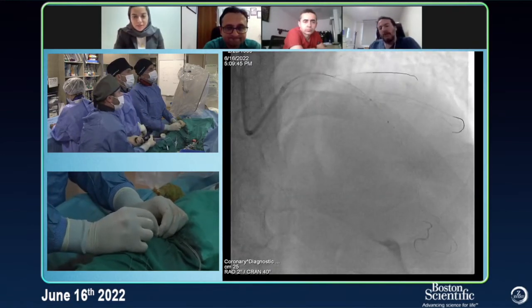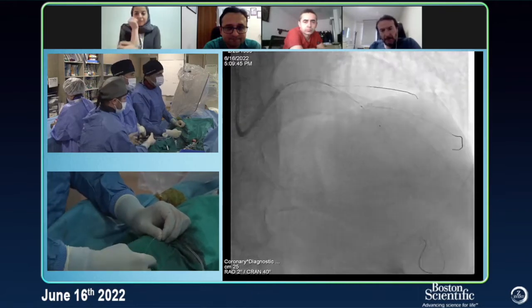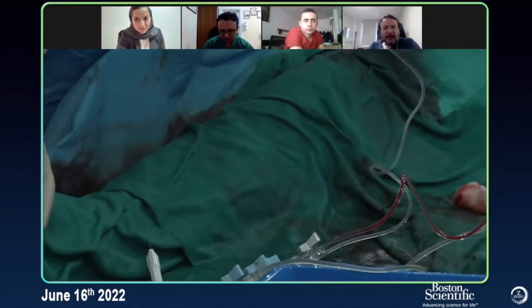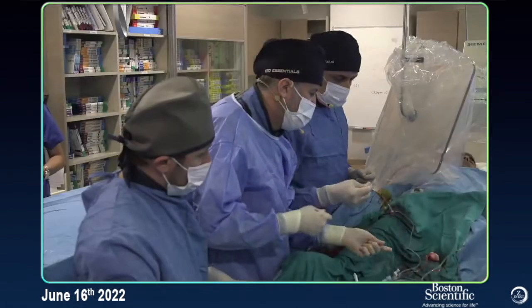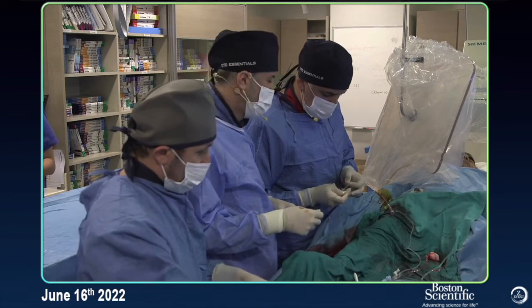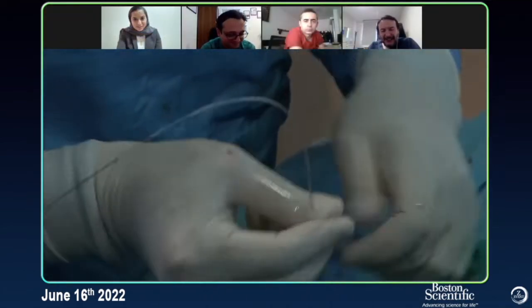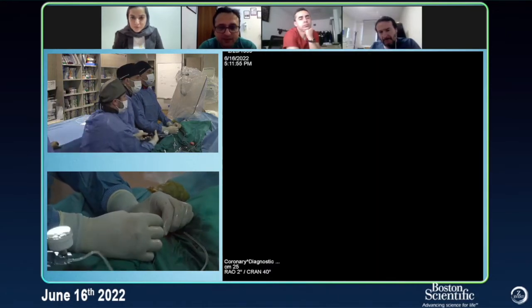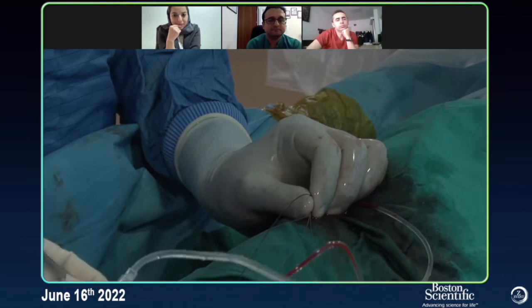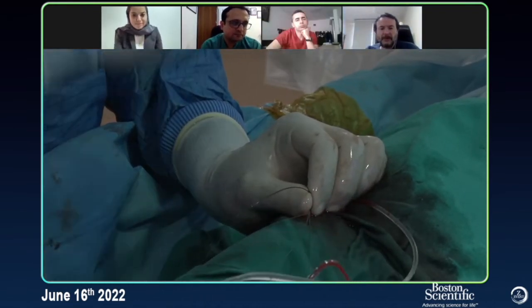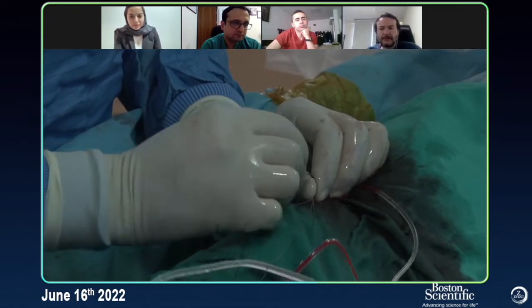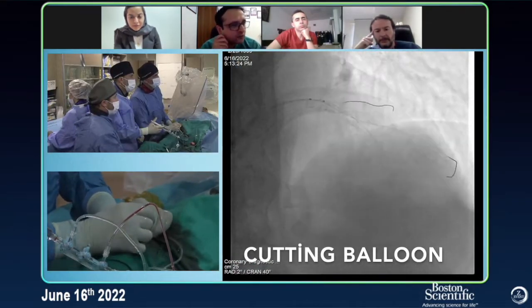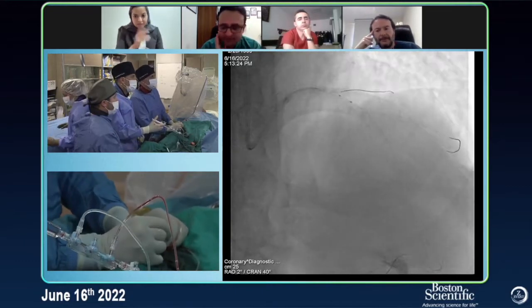It's one of those lesions — it's opening nicely, but before inserting the stent, I like to go at the proximal part with a 3.5. I might use a cutting balloon here if it's not opening now. That's why I like to try 3.5 — if I went directly to a stent after rotablation, I wouldn't see that expansion. In terms of sizing, the cutting balloon — you knew the vessel size was around 4 mm, so 0.5 smaller will prevent any major dissection. Probably great sizing.